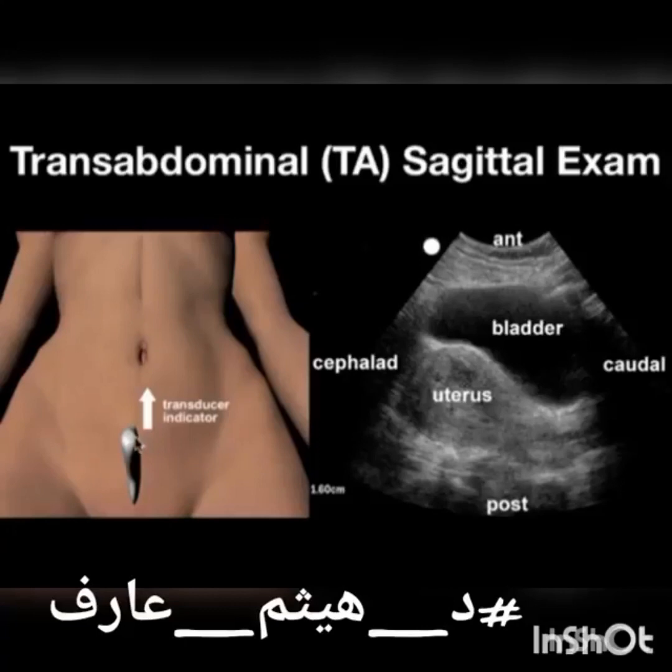This exam is going to be performed with the transducer in a sagittal plane with the indicator directed towards the patient's head. The transducer should be placed just cephalad to the pubic symphysis, and this will give you this image: anterior, posterior, head, foot. Here you've got urinary bladder in the near field. You can see some reverberation artifact here, which is common.